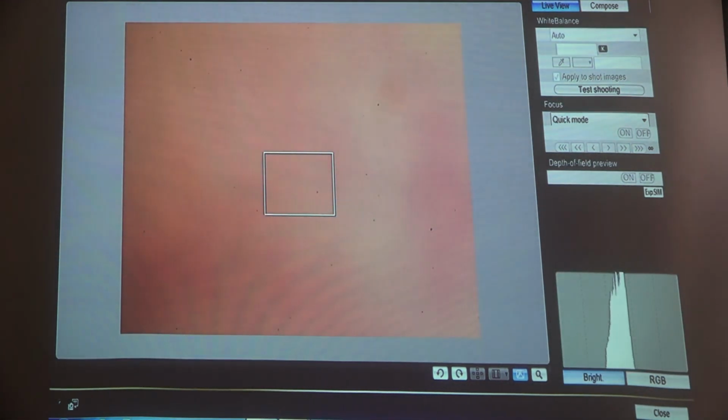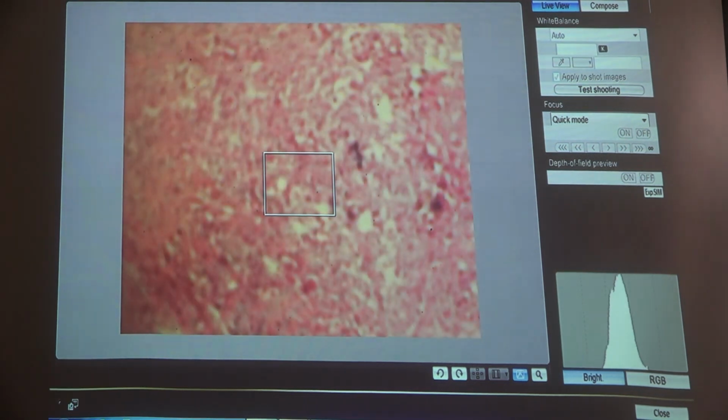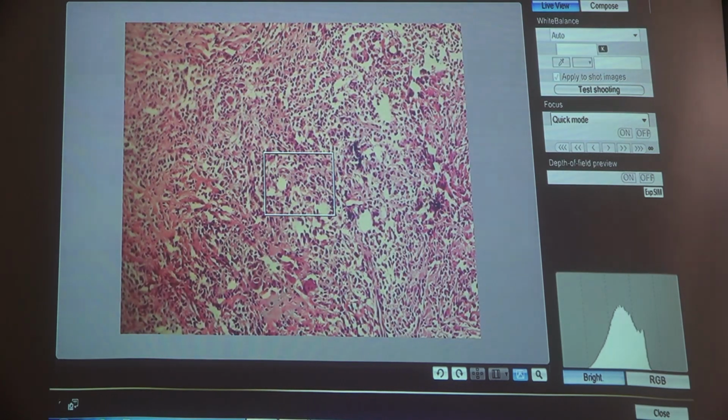cells in addition to giant cells, foreign body giant cells, in addition to fibrosis. The spindle cells here is fibrosis, fibroblast proliferation. These are fibroblast proliferation. This is giant cell, foreign body giant cell, and these cells are chronic inflammatory cells, mainly lymphocyte and histiocyte. This is granulomatous reaction.